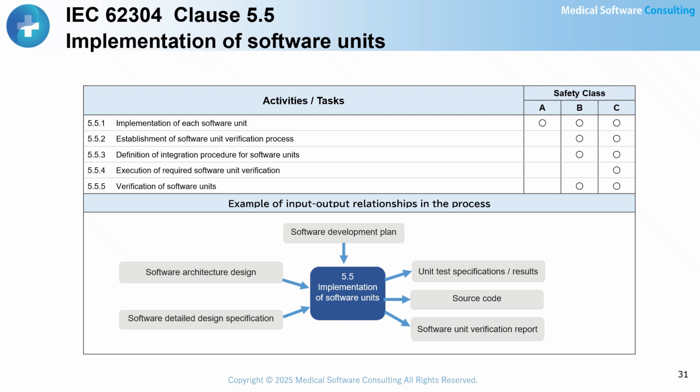For software units classified as Safety Class B or C, clear acceptance criteria for unit testing must be defined. Furthermore, for Class C software units, additional acceptance criteria should be included when necessary. These additional acceptance criteria may include the following: A. Correct event sequences. B. Data and control flows. C. Planned allocation of resources. D. Exception handling, including error definition, detection, and recovery.